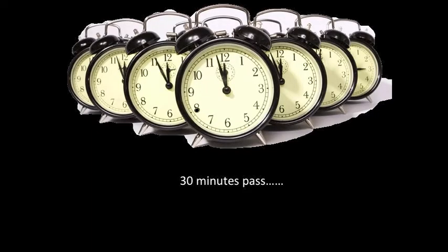In our clinical setting, it is not typical for non-invasive ventilation to be performed in cases that are time dependent. In this scenario, let's pretend that our patient is settled on non-invasive ventilation after a certain period of time has elapsed, and we will discuss setting titration and oxygen consumption.